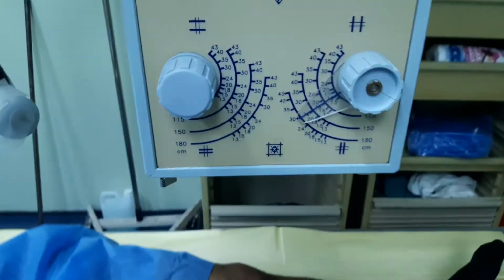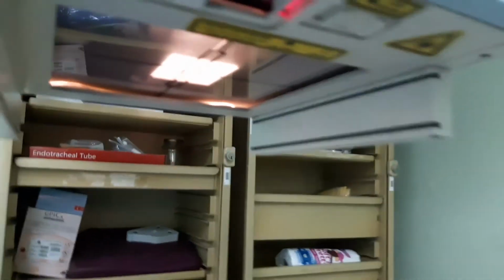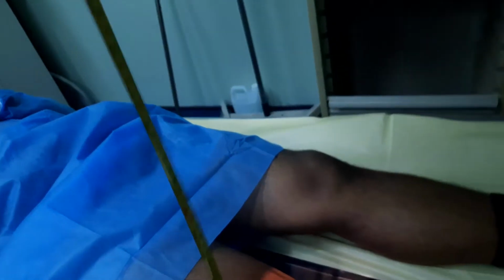And from there, you make sure your cassette is also centered well and aligned with the direction of the leg. And you're using a straight tube, a normal 90 degree, right? Estimate or measure. I don't know if you have a measure. Oh, yes, we do. So you can measure your SID. Make sure you're at your 40 inches. And you center at the point that you just measured.